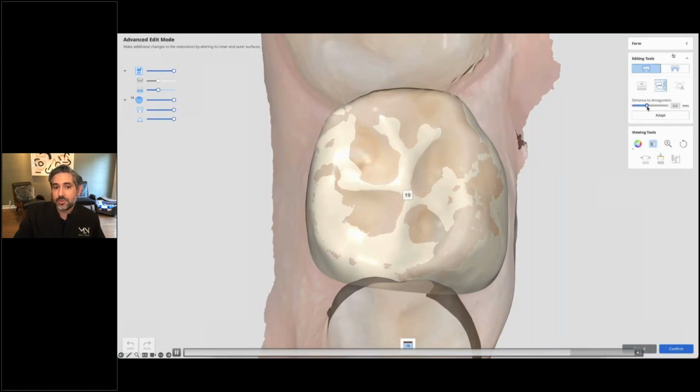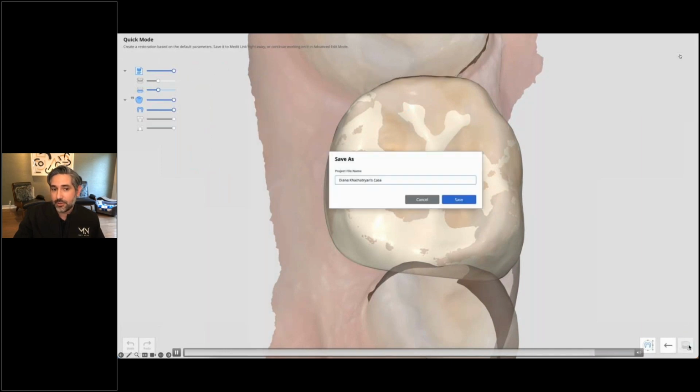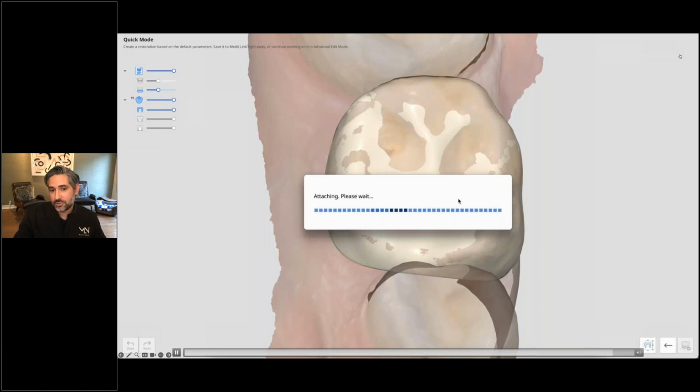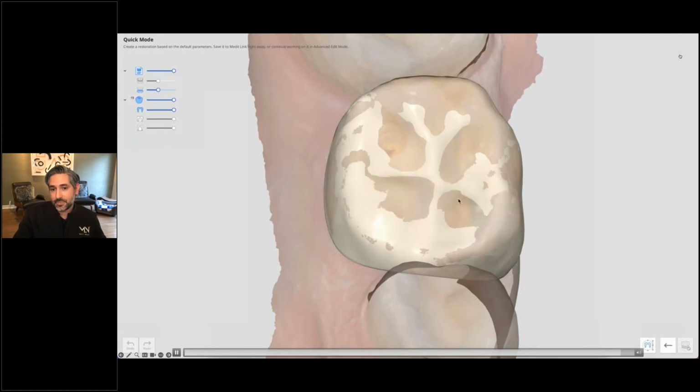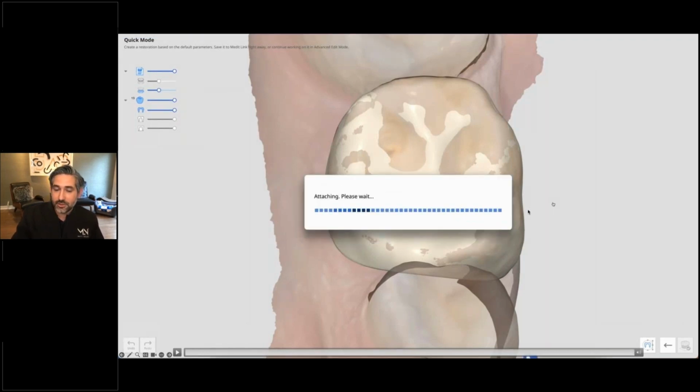and then I'm going to do this adapt to antagonist, and now we can click finish, and now I actually have a 3D printable shell that I can use for this situation. So in this case, I had both things ready, and I was able to use that shell. So that's something I want to do more of.